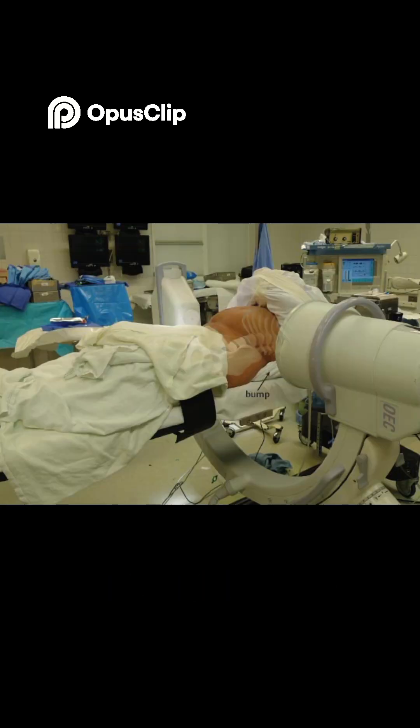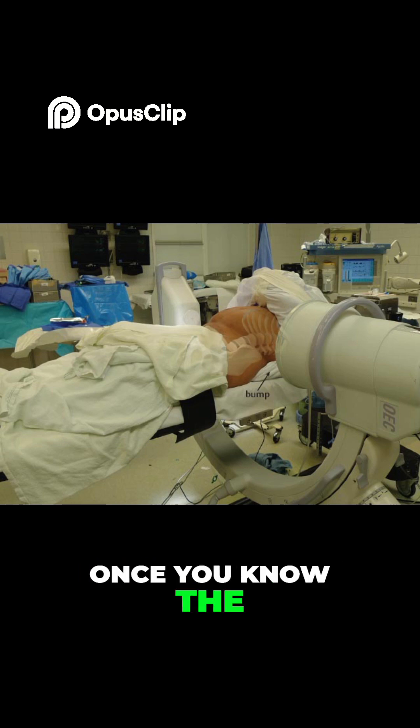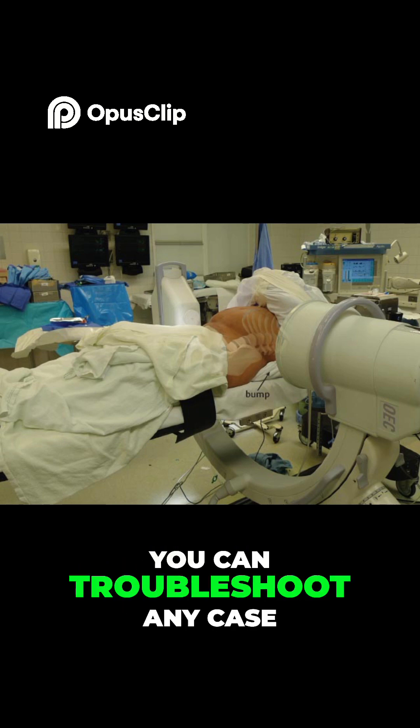Tip 9: Fake it till you make it. Confidence is key. Once you know the C-arm's locks and moves, you can troubleshoot any case.